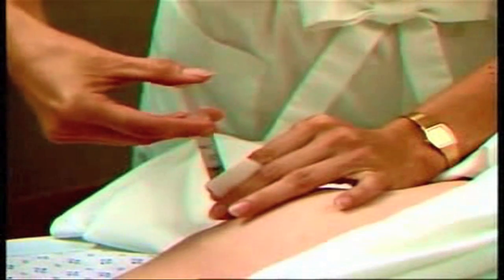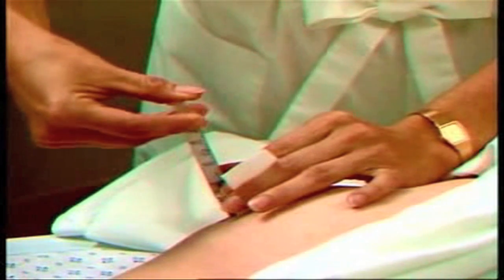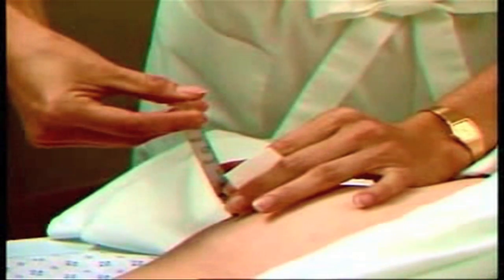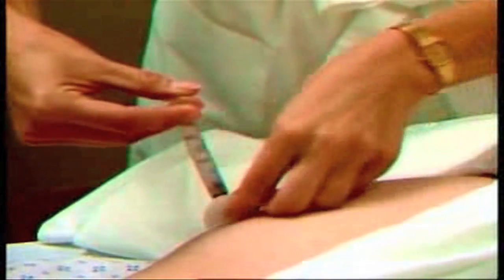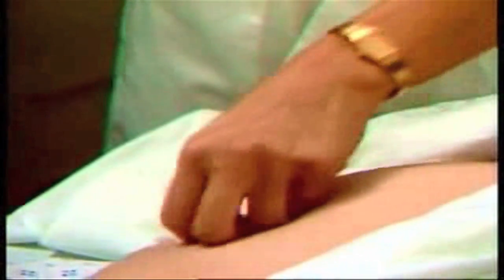Then select a different site using a new needle. Slowly and steadily inject all the medication and the air bubble using even pressure. Place an alcohol wipe near the insertion site and quickly remove the needle. Cover the site with the alcohol wipe and gently massage the area using a circular motion.